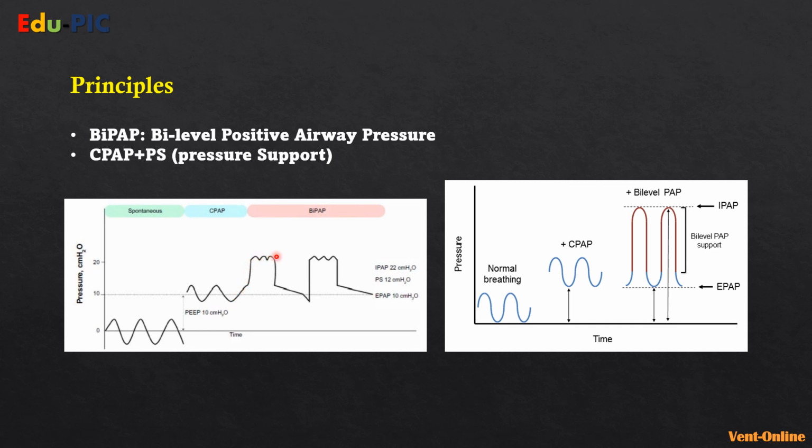You add higher pressure that would push oxygen and air in, and then allow for an exhalation or expiratory phase, then push again, allow for expiratory phase. These bits are basically where, if the inspiratory time is long enough, the patient would be expected to still breathe on their own around these pressures, and then go down again. What's happening here is, if your patient is not really having a good respiratory drive, then you're giving them breaths, which should improve your ventilation. But also, you're adding higher pressures with delta Ps that should improve your MAP, or mean airway pressure, to be above the level of CPAP while still pushing breathing in.